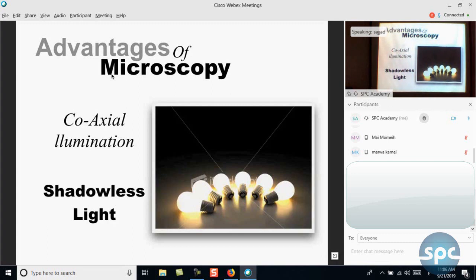So you tried different combinations, and then you put your contra in front of it, and it shows even more shadow. So now you can't see it all, and after you give up you take a couple of looks, a couple of looks. So you're working by chance. And this is because within the mouth you are creating shadow, and shadow is because your eyes are in one direction, your line of view, and the light is also at a different line of view, at an angle. So no matter how much you try, there's always going to be part of the canal or part of the cavity with shadow.